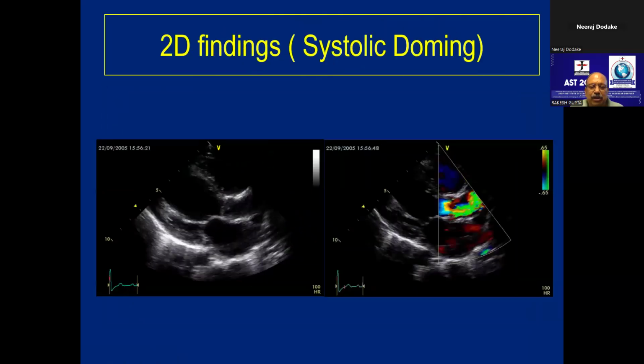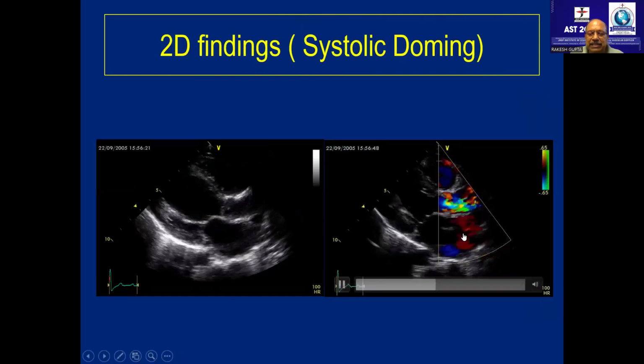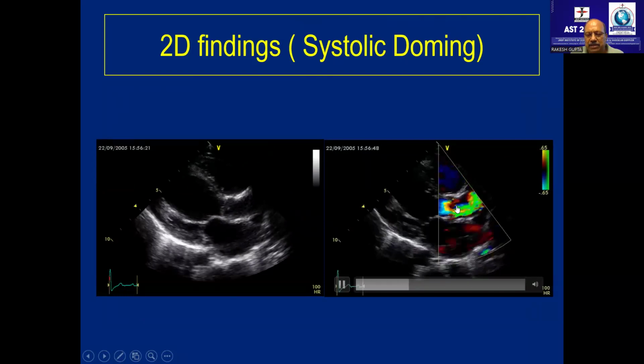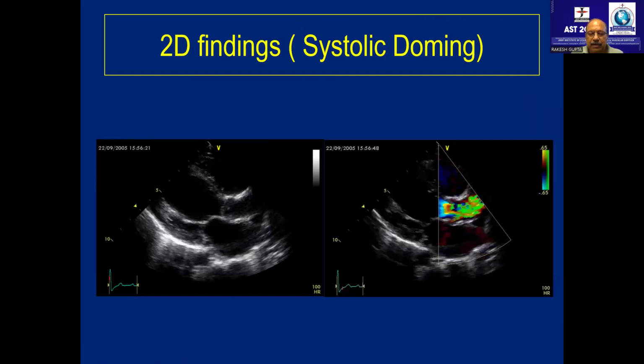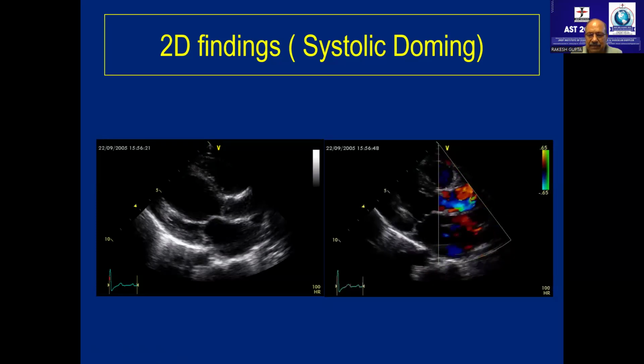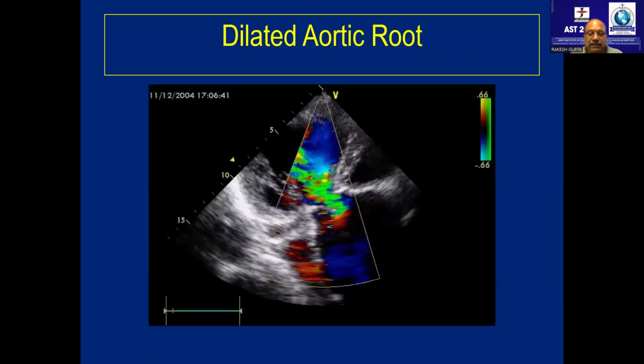And second thing, if you are not really sure about it, what is the answer? Put a color flow across it. You will get an immediate answer. If there is an obstruction, there has to be turbulence. Look what exactly happens when we come out of a picture hall. All people assemble at the exit gate. So many people are crowding at the exit gate. It means there is a significant amount of turbulence at the exit gate to get out of this picture hall. Same thing happens over here. Here the gate is small, but a lot of blood wants to go out of this.